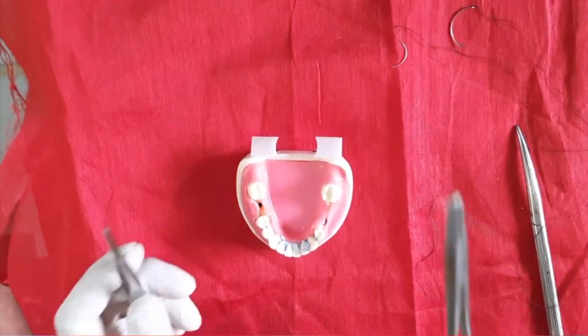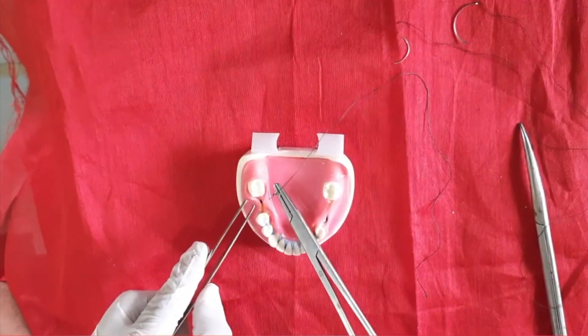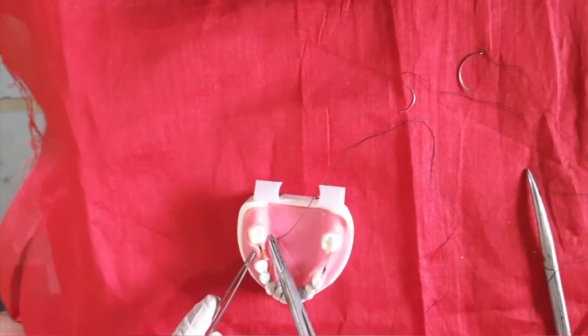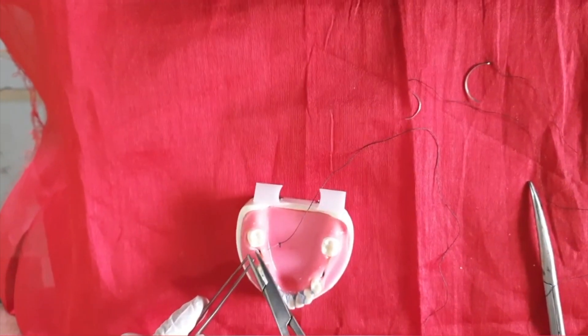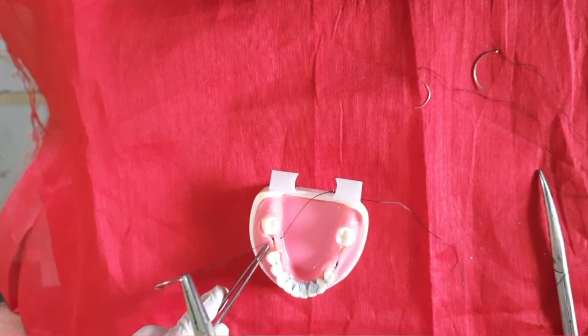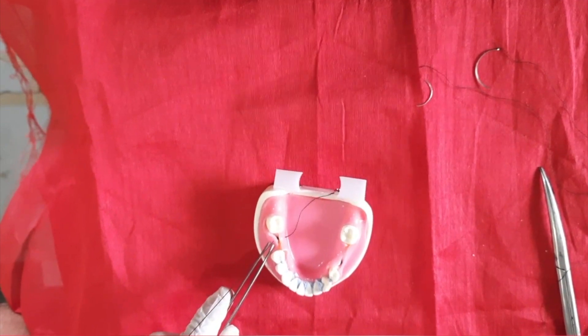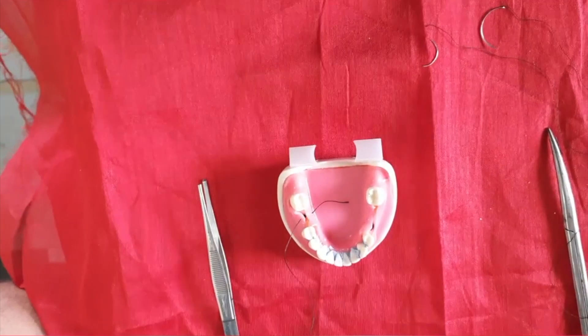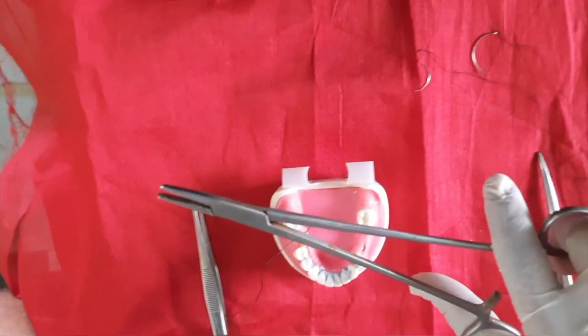The first one is the simple interrupted suture. Hold the needle and enter it into the tissue at a 90-degree angle, then remove it from the other side. Hold the other end and pull it slowly — be careful while pulling. Keep some thread end on the other side.